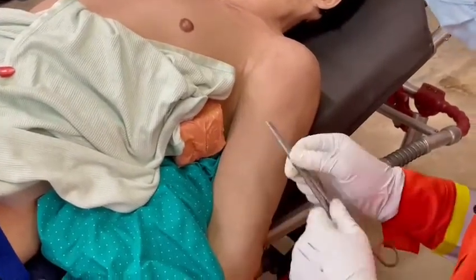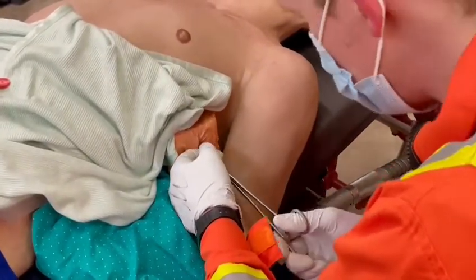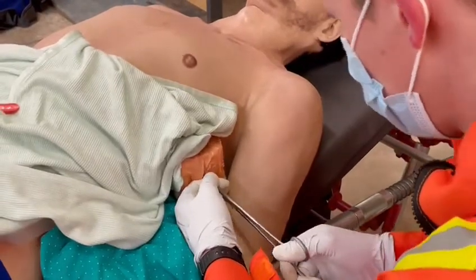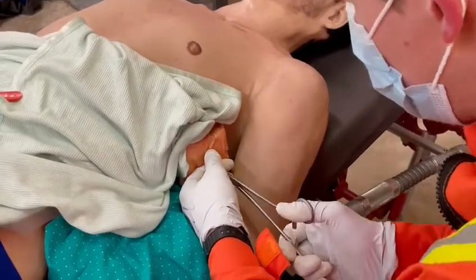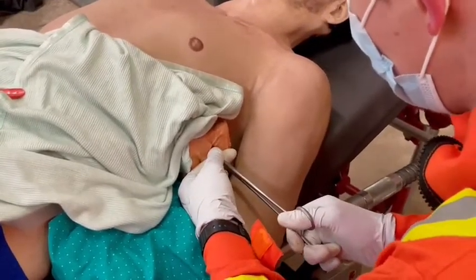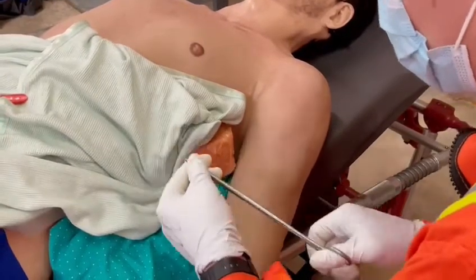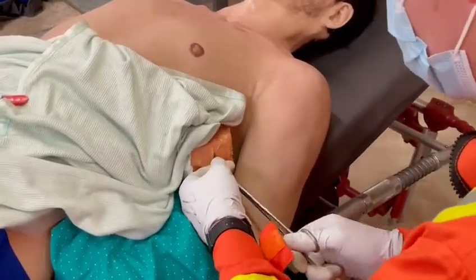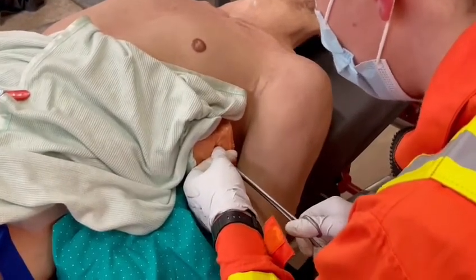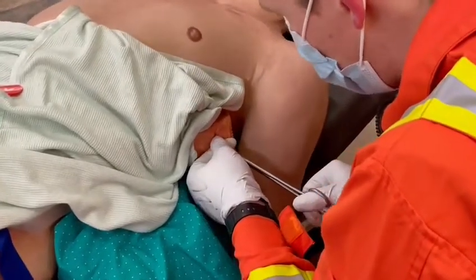I'm going to use the Spencer Wells forceps to insert into the incision, pushing apart and squeezing the muscles to get down to the pleura. I'm working to strip apart and push apart the muscles to make a tract down into the chest cavity. I'll keep the tips closed as I work downward, occasionally opening slightly to spread the tract. Once I feel I'm through the muscles and over the top of the rib, I'll positively push through — controlling it so I don't go in too deep — and pop into the chest wall.